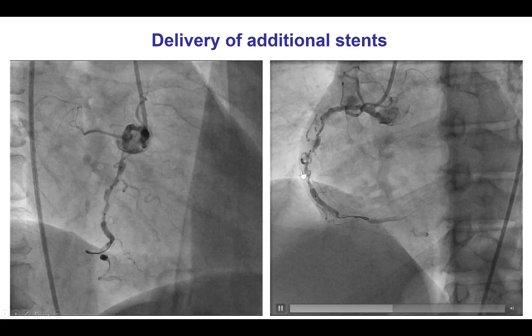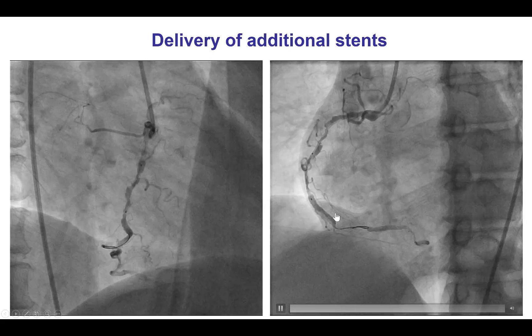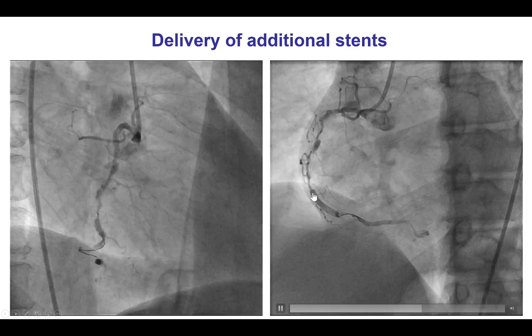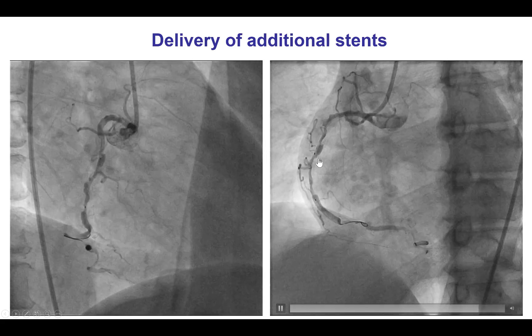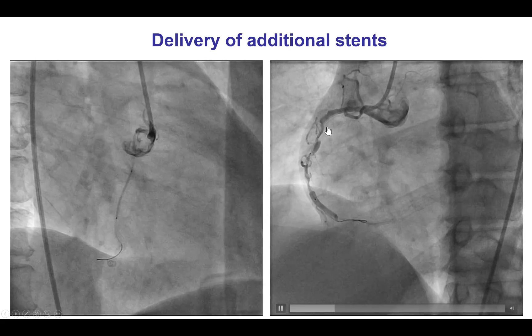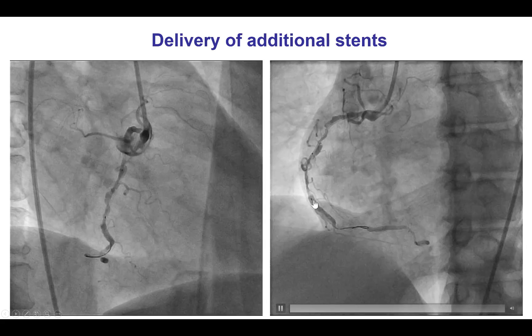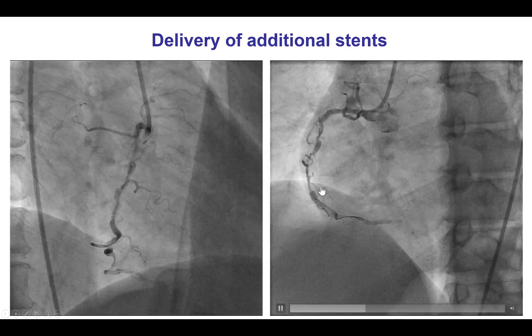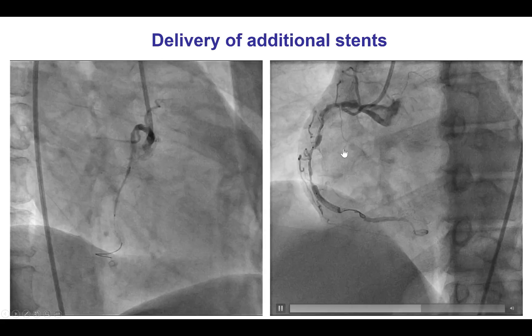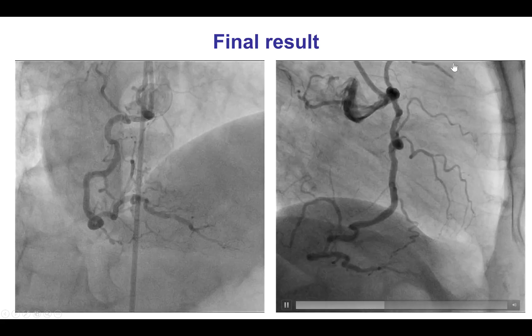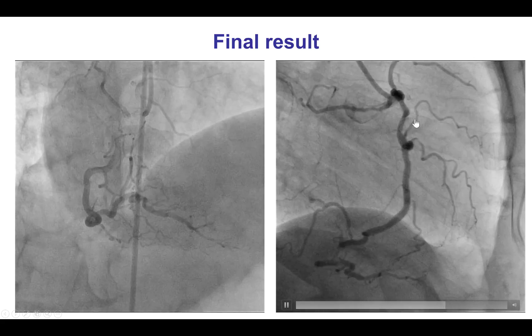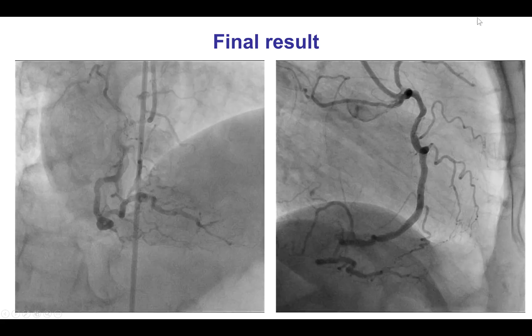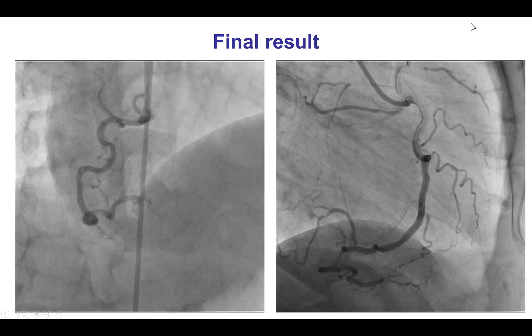Once very tortuous vessels are wired, it is not uncommon to see a very ragged appearance, which is not necessarily a dissection problem but may just represent straightening of the tortuosity from the guide wire. After delivering the stents, a nice result was achieved with TIMI III flow in the vessel.